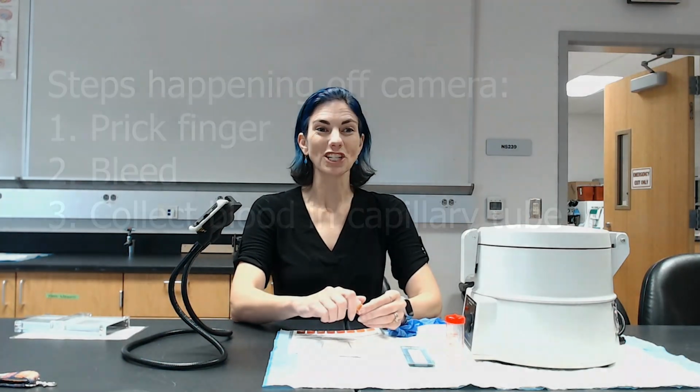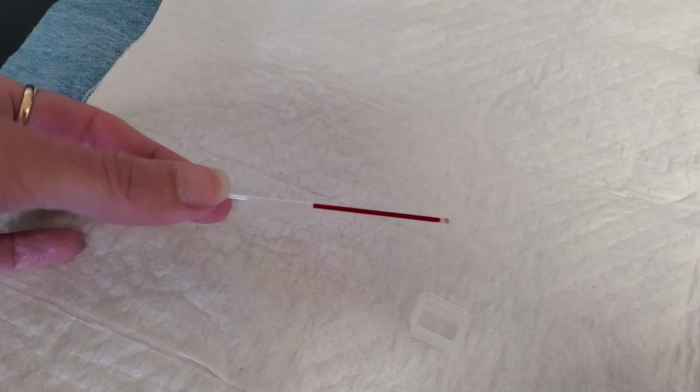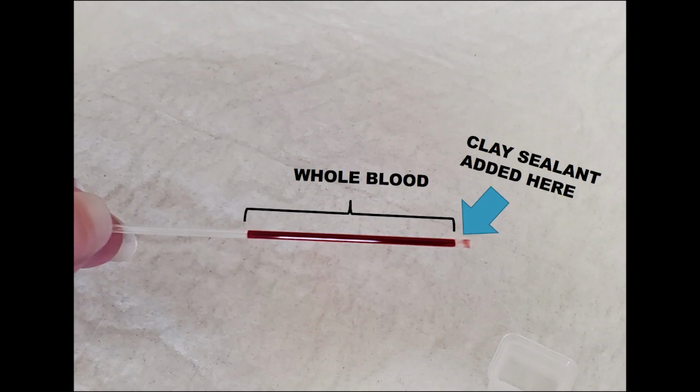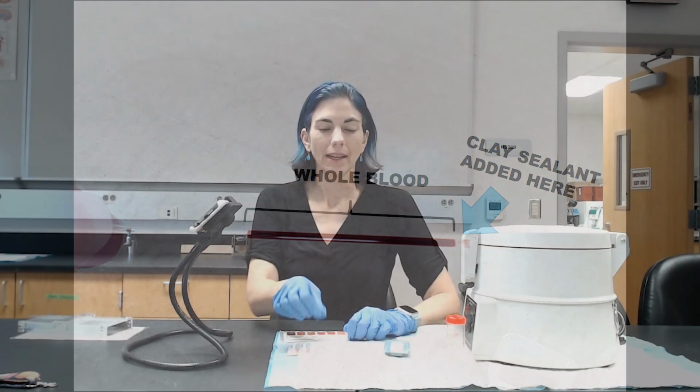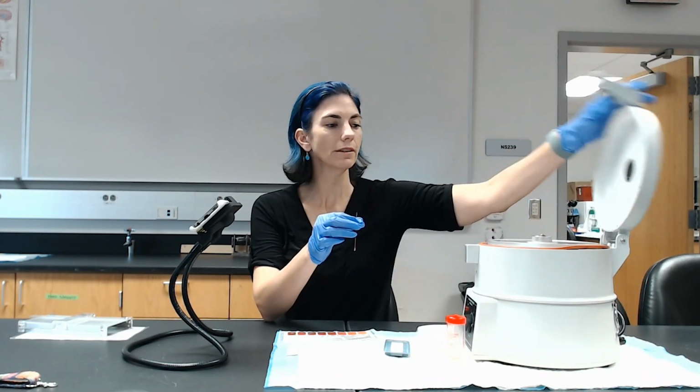All right, let's watch. All right, now that I've collected my blood, I'm going to go ahead and put it in the centrifuge here.